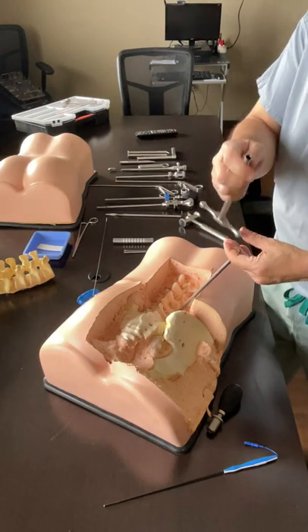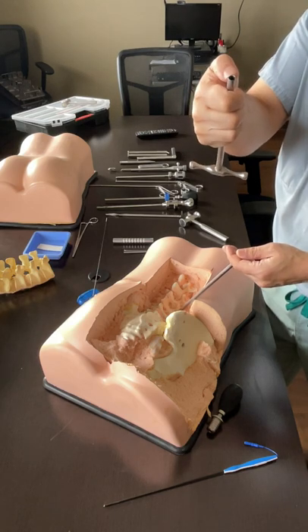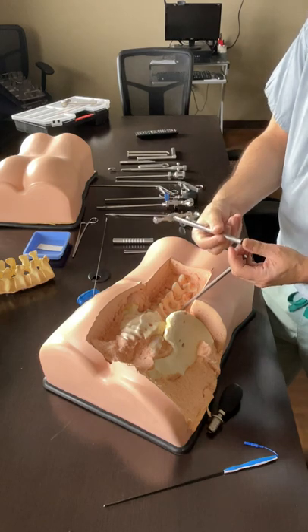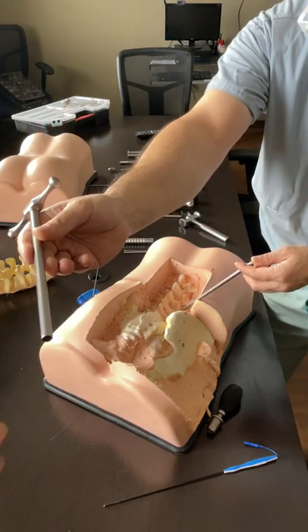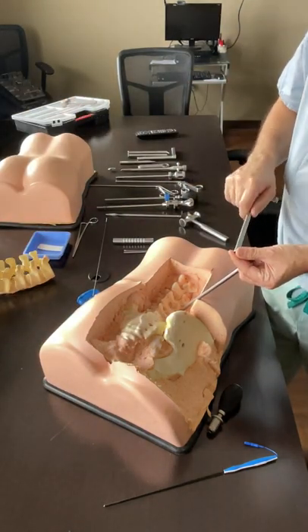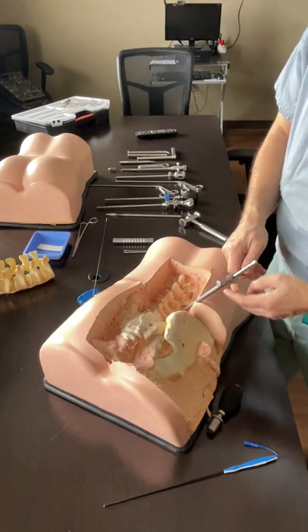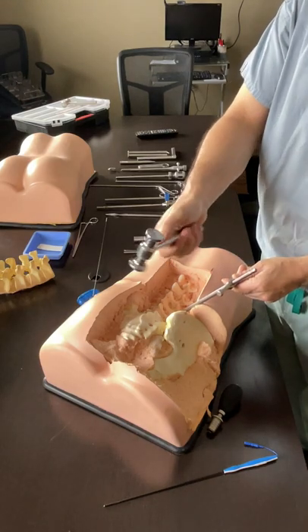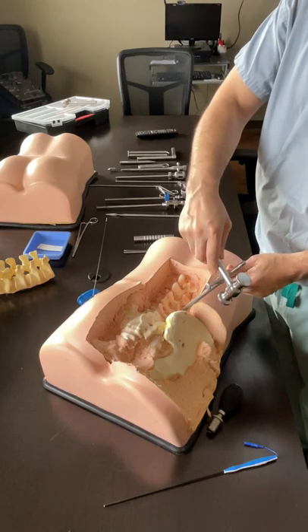This is another perk: make sure the tube is not overused, and that the tips are truly smooth. If it is chipped or has a sharp corner, that is what you're going to pass next to the nerve root - make sure it is truly smooth. Walk it through your finger; you should feel that it is smooth. Then you go in again, massage it, and pass through the fascia and whatever tissue is there. Once you are on the hard surface, you can use the nut with the hammer - don't use the top of the hammer, use the handle, because they stop each other and you don't slip. Either do this, or you can use the barrel on top and tap it in.